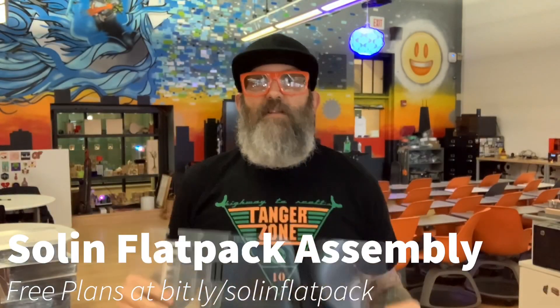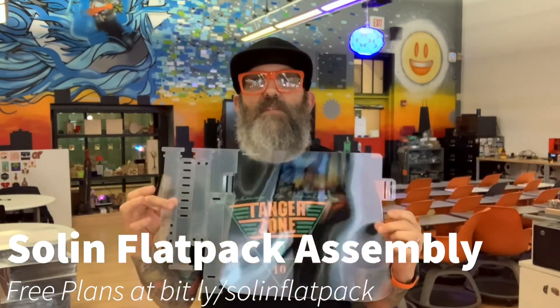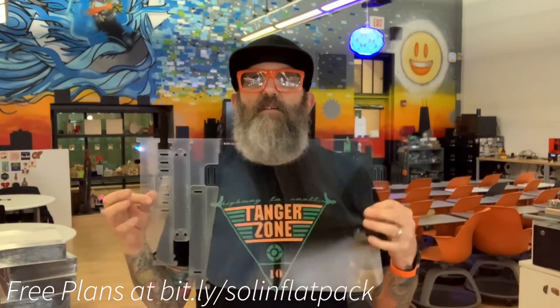Hi, I'm Jeff Solin. I'm here to demonstrate the newest design and iteration of the flat pack face shield.